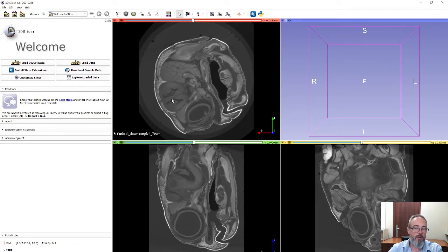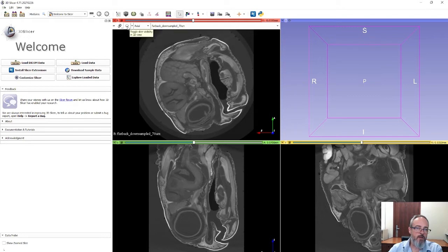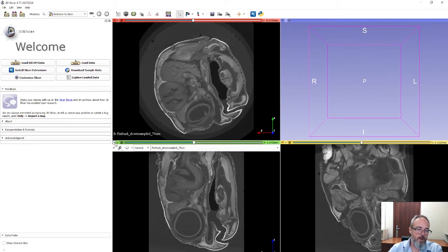You should be looking directly down each of the red, green and blue lines. You can check on that by hovering your mouse over the little pin icons and ensuring that these are set to the appropriate value. It's always nice to see these in the 3D window as well, so do that by clicking on the eye icon, which will make the view visible in the 3D viewer. Do that for each of the views.